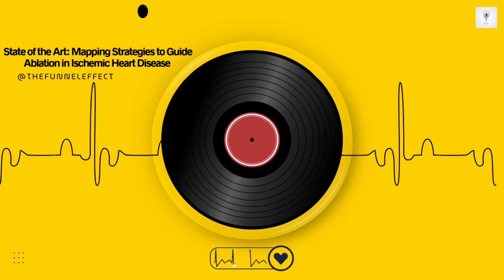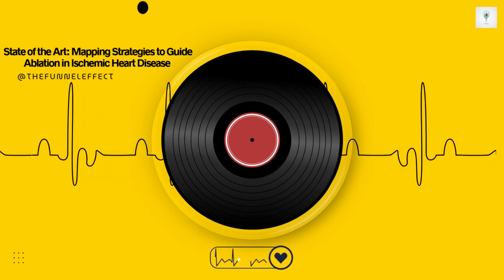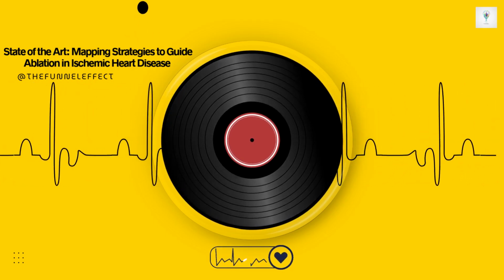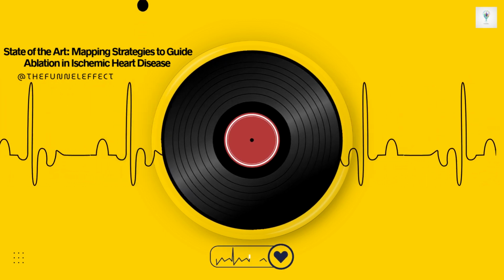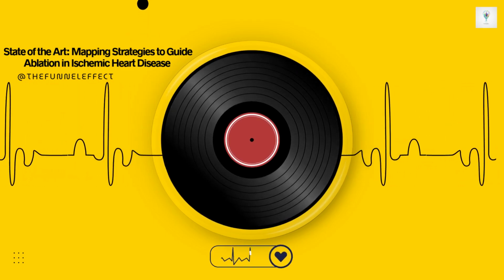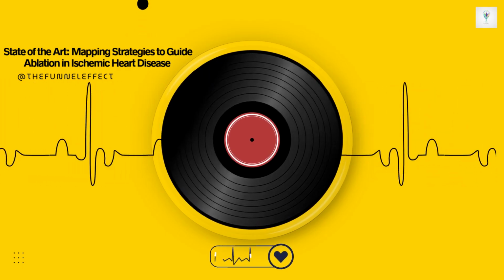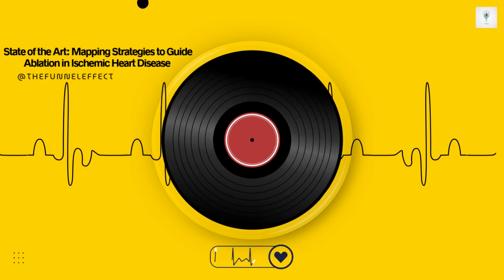That seems incredibly powerful. How specific are these functional markers for the actual VT circuit compared to just finding LPs? They're generally considered much more specific for the VT isthmus than LPs alone. Studies have shown pretty good sensitivity, sometimes up to 90%. One group, Martin and colleagues, found that essentially all the reentry circuit isthmuses they identified had these functional potentials associated with them. And targeting these sites works.